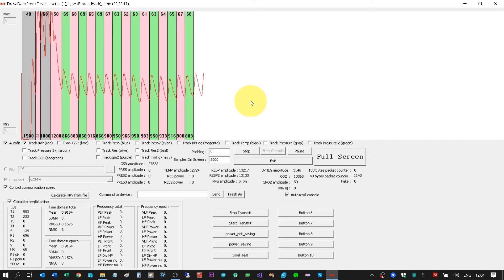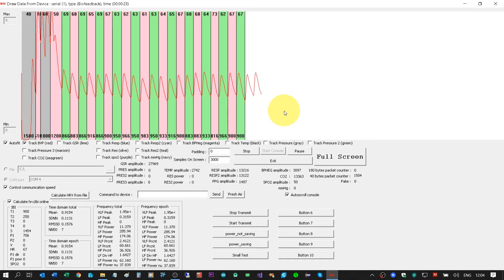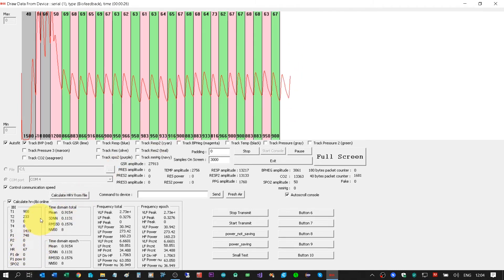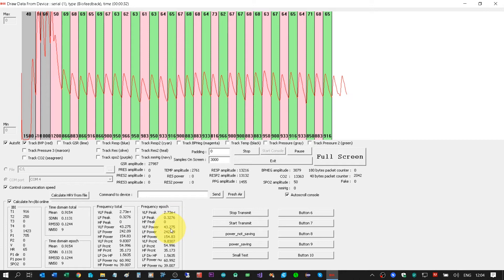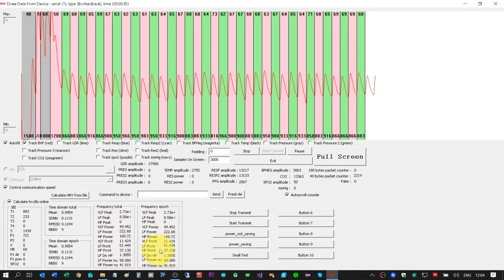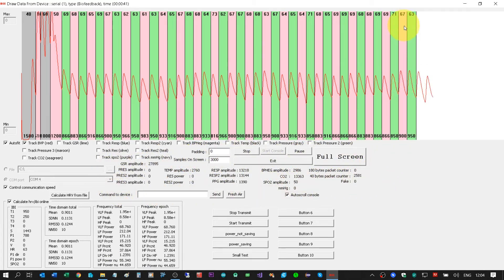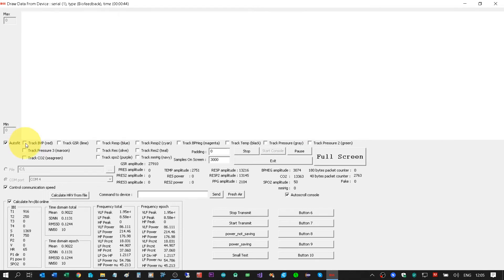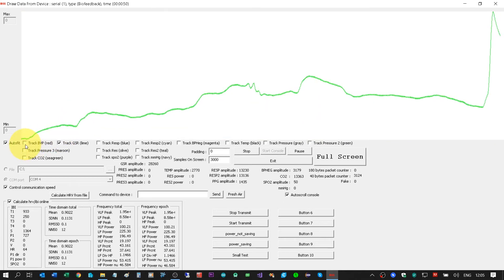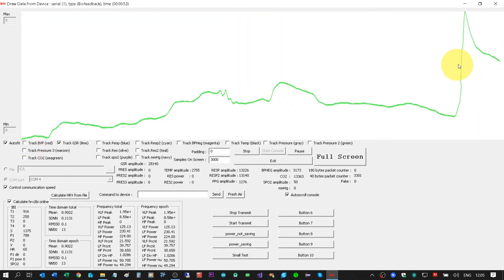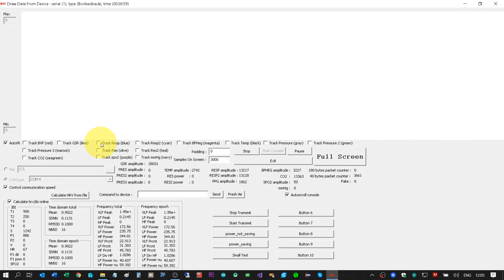I have different options with the check buttons. If I click on Track BVP, I will see the blood waves from the heart sensor, with heart rate and blood volume pulse amplitude. I can also see in real time all the inter-beat interval data and all the HRV analysis calculations. The second option is GSR — the GSR graph — and the third is the respiration belt, where you can see the breathing.